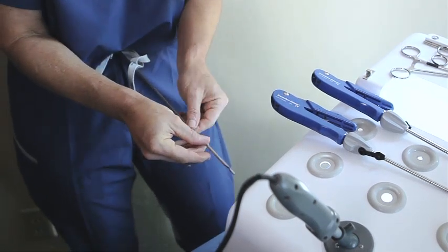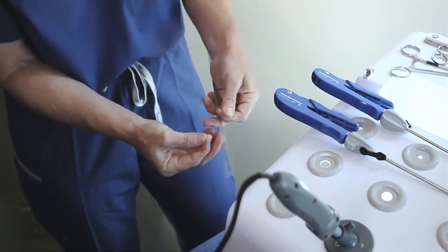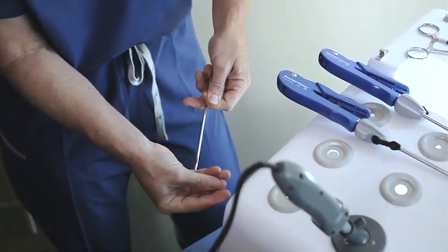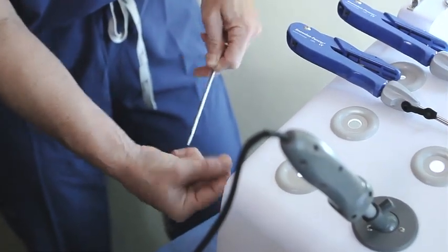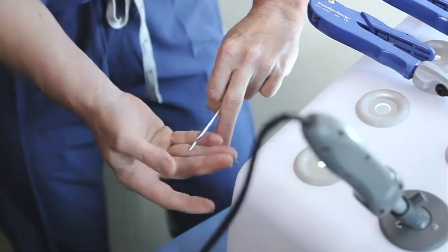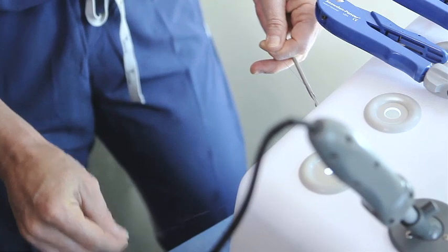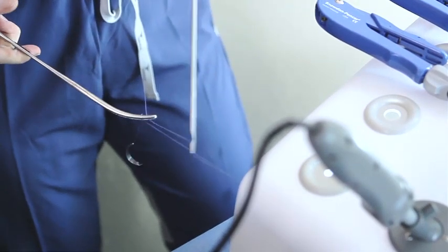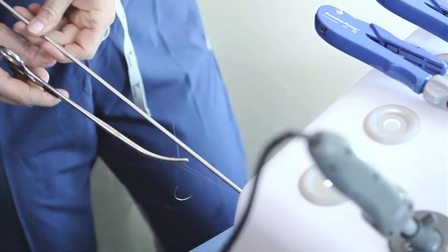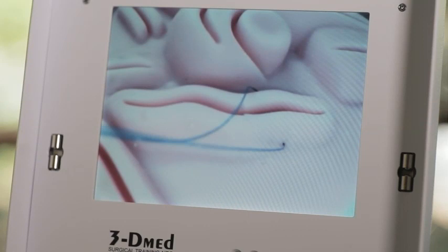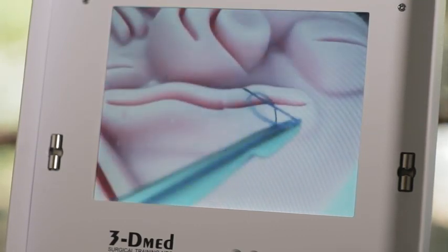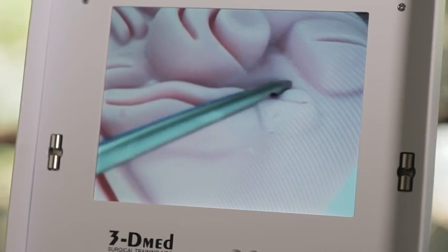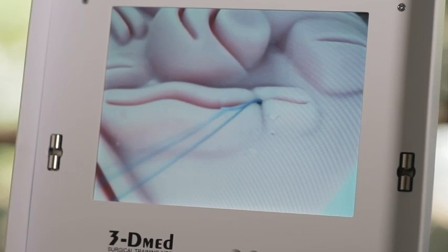With the needle outside, I will begin to tie my knot using the extracorporeal knot pusher. Some call this a knot puller because that's another way it's used. Holding the suture in one hand, I will tie a one-handed surgeon's knot. Here's the other part—this makes it a surgeon's knot. Then we will pass the knot down by holding both sutures in a hemostat. I will guide the knot down. The knot is now going to go down and I'll hold it just past the tissue. It's tight. I'll come back. Surgeon's knot is deployed.